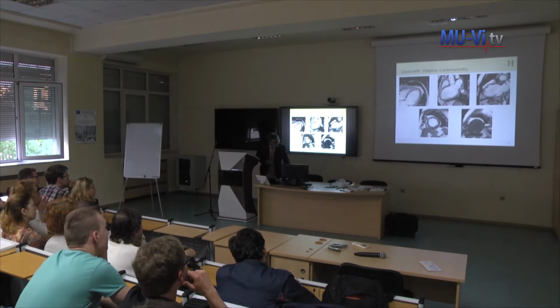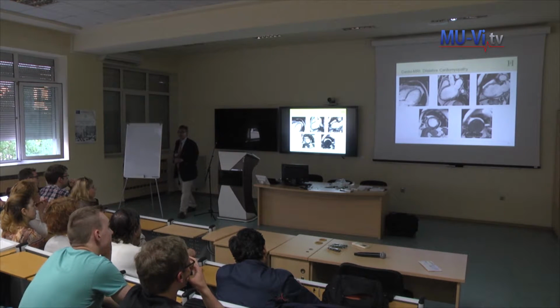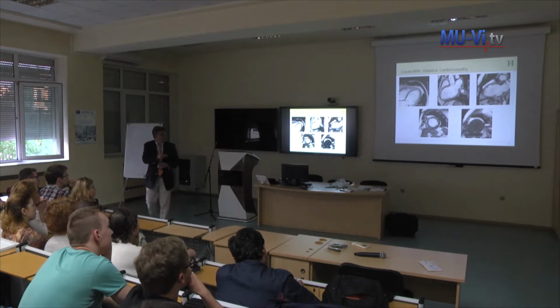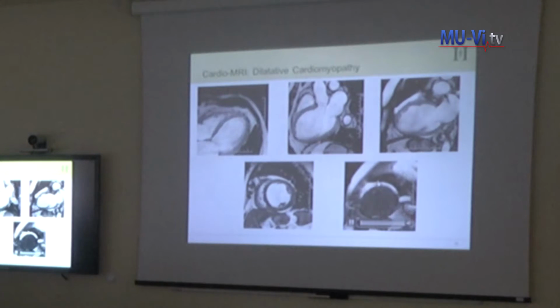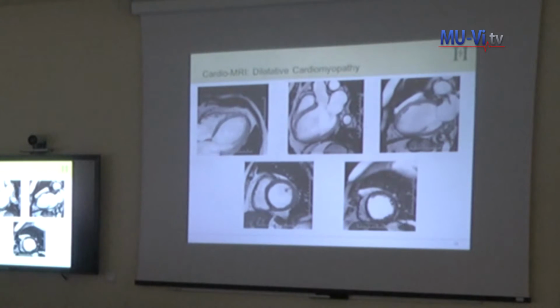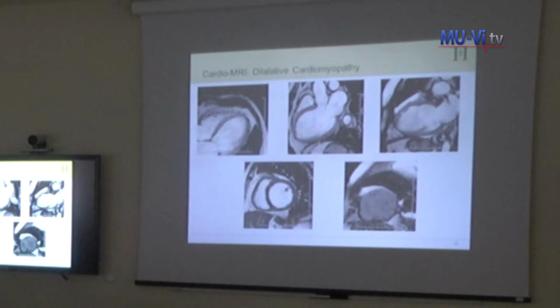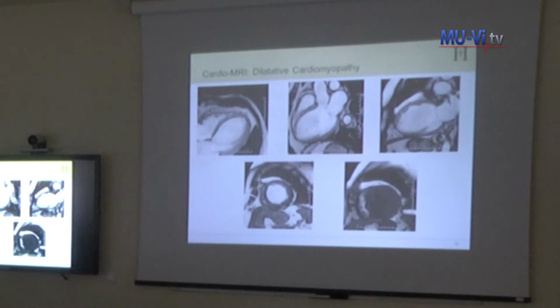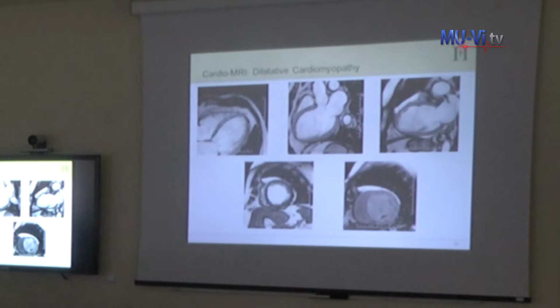Oh, sorry. This is what happens if a myocarditis patient doesn't rest enough. He gets a dilatative cardiomyopathy. You see the heart, here the left ventricle, but the wall movement isn't very strong. It's an ejection fraction under 35%, under 30%, and this is not a nice disease because of what? What kind of problems do you get if you have a heart like this?